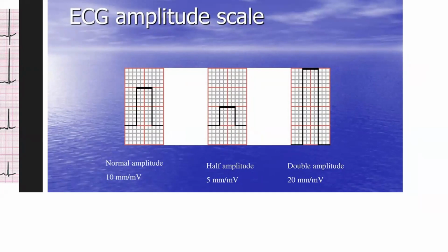So it is just information for you to understand that typically, without the machine adjusting, the ECG complexes are very tall. So when would you have very big QRS complexes, or complexes for that matter? If the heart is enlarged, for example, you will have a very big amplitude of your complexes. So left ventricular hypertrophy will cause extra large complexes, and therefore the machine will decrease it.